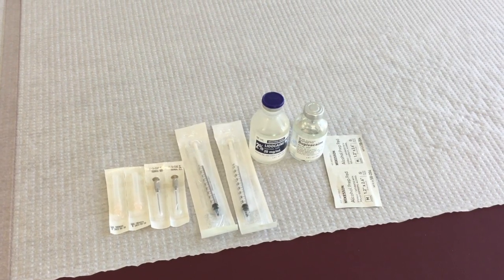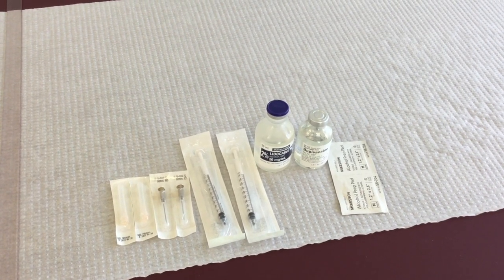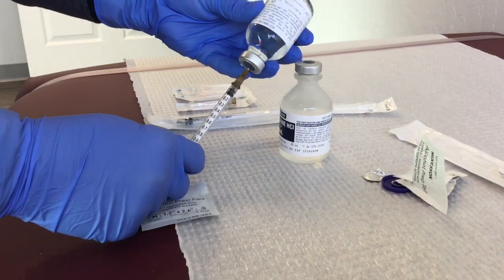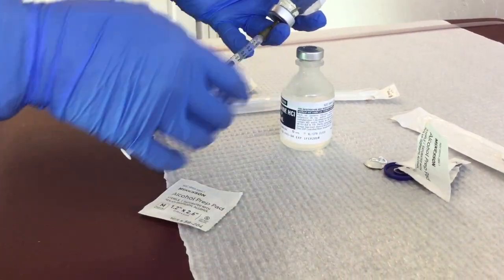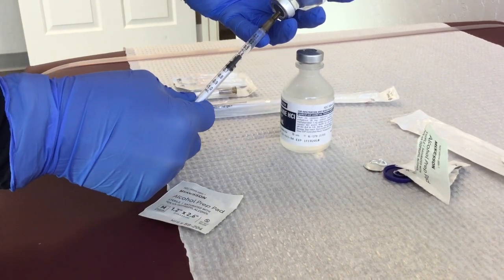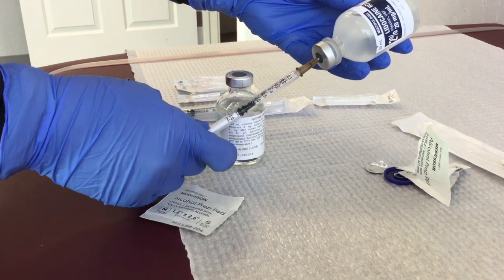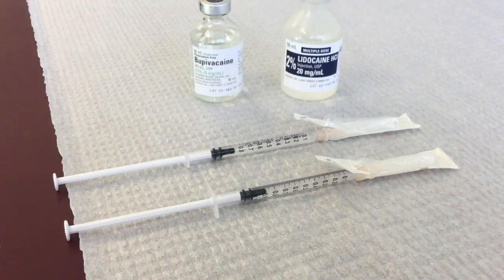First, prep the syringes for the injections. Each syringe is filled with 0.5 milliliters of bupivacaine and 0.5 milliliters of 2% lidocaine. They are 30-gauge insulin needles and 1 inch long. No need for anything bigger, and you can even go smaller than this.